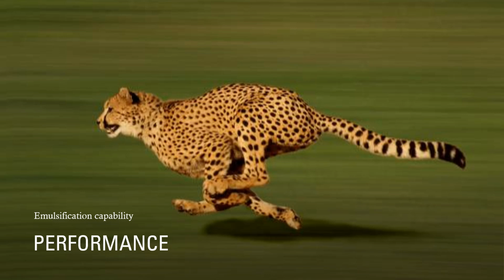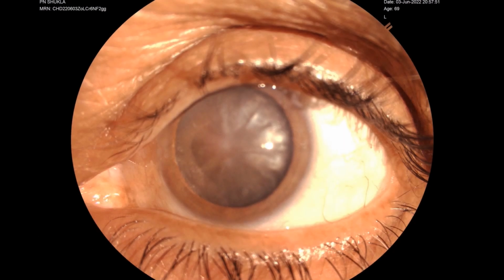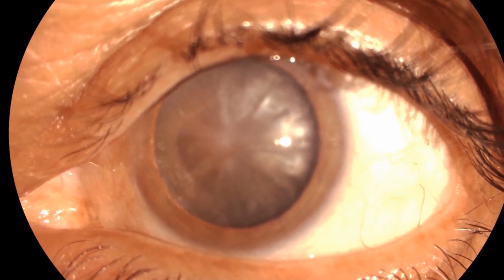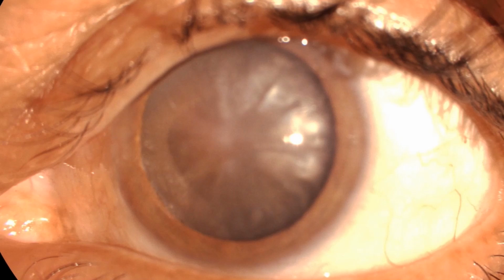Coming to the performance, I'll just demonstrate one case which was done for removing a hard cataract. This is the kind of cataract we are talking about. And the machine which I was using was Appasamy Associates. So this is one patient who presented to me with other eye being pseudophakic, which was operated few years back by me, and the patient waited so long for this eye that this cataract became something like grade 5 and beyond.